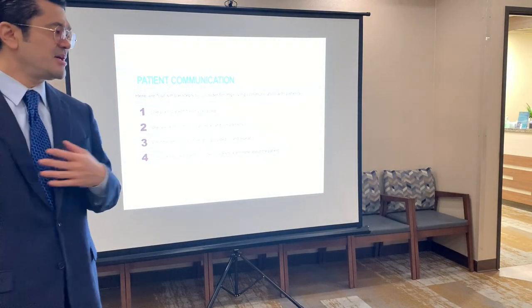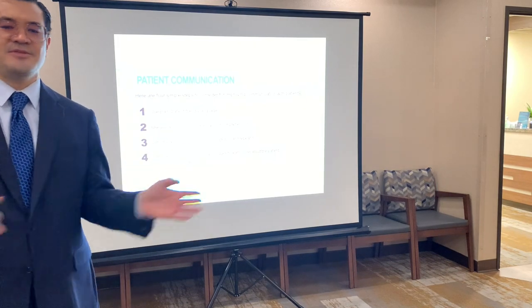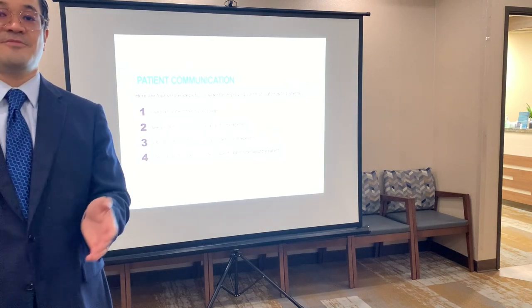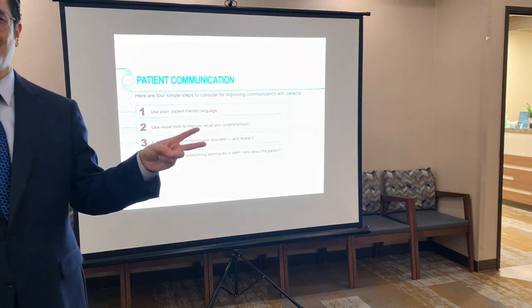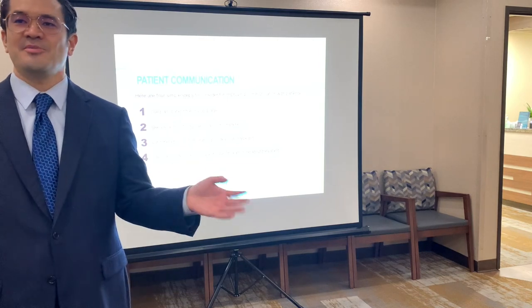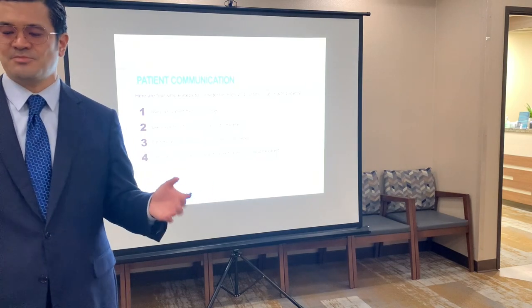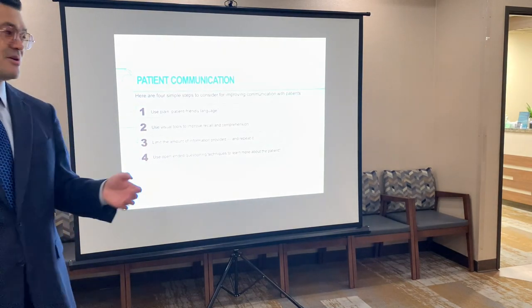And one thing that I like to do is, when we know they already are not a candidate for certain technologies, we don't even talk about it. We only talk about the technology they qualify for, and that really makes it more streamlined. We can say, hey, because of your eye disease, you have macular degeneration, these are your two options. You can do A or B. And having two choices is a lot better than, well, we have the Eyhance lens, the Light Adjustable, we've got PanOptix, we've got Aura. It's too much. We try to streamline it for them so they don't have to know what an LRI is and a CRI, and it's just too much to process. So I like to summarize it. These are your options, the three pathways or the two pathways you can go for surgery.